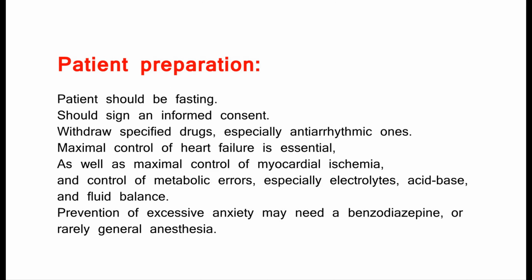Patient preparation. Patient should be fasting. Should sign an informed consent. Withdraw specified drugs, especially antiarrhythmic ones. Maximal control of heart failure is essential, as well as maximal control of myocardial ischemia, and control of metabolic errors, especially electrolytes, acid-base, and fluid balance. Prevention of excessive anxiety may need a benzodiazepine, or rarely general anesthesia.